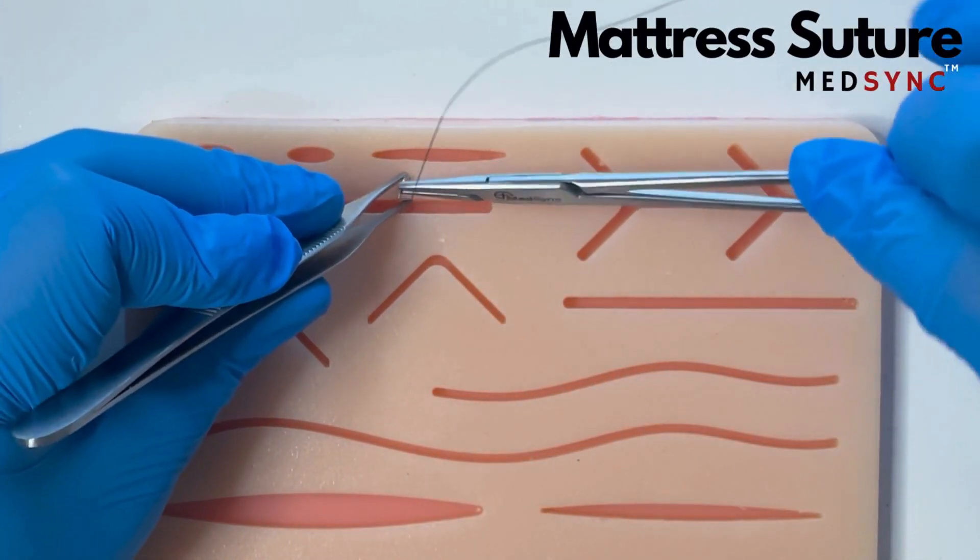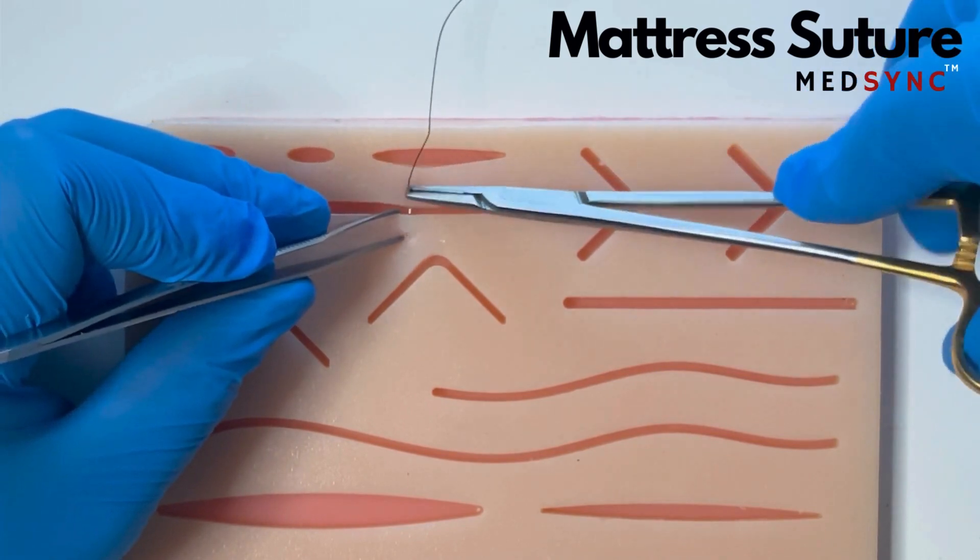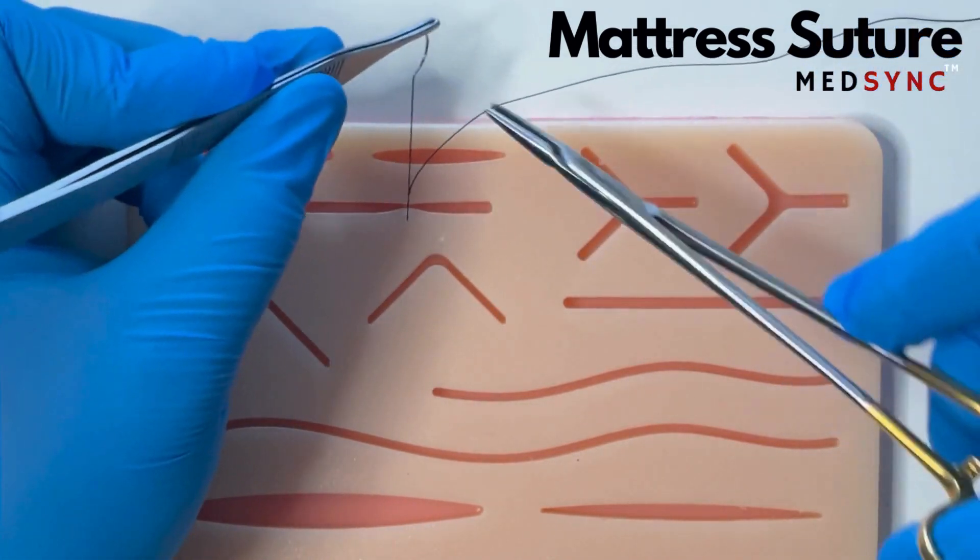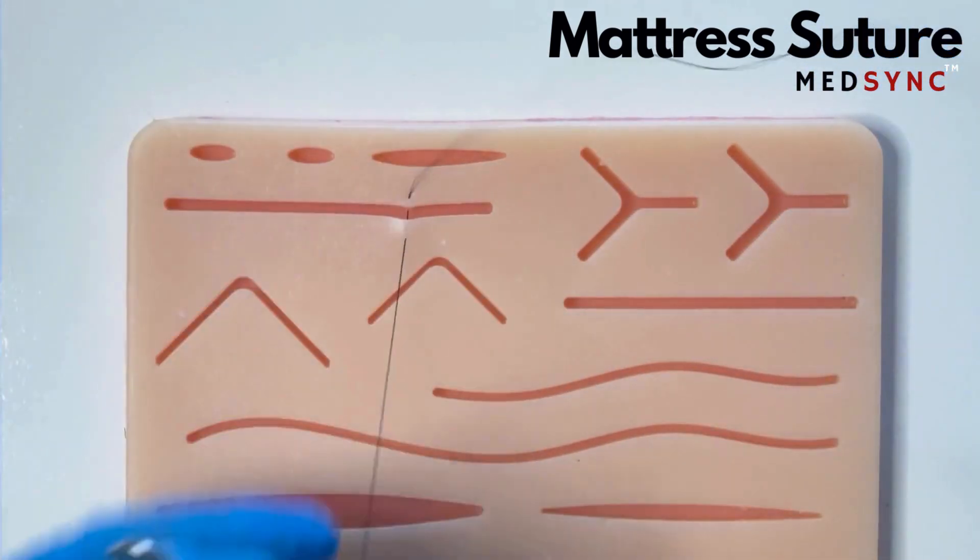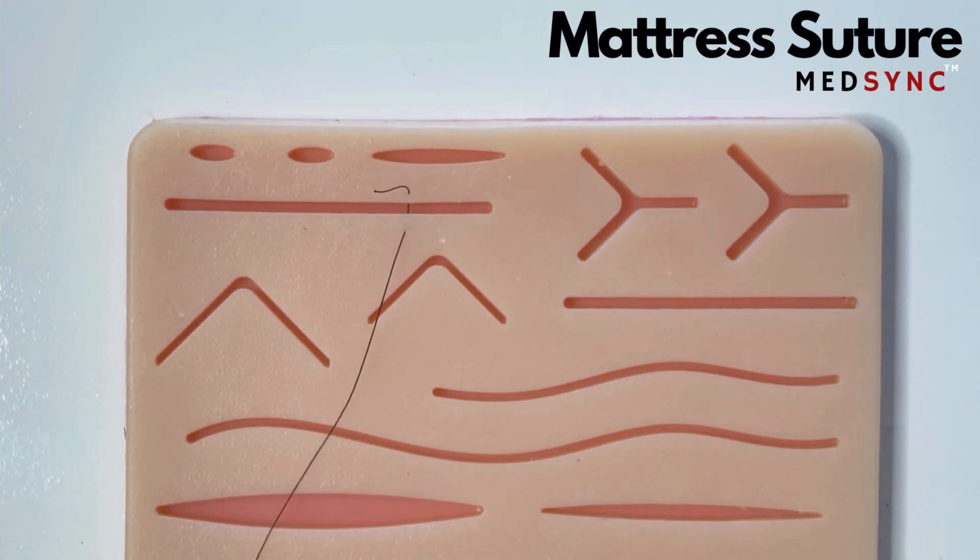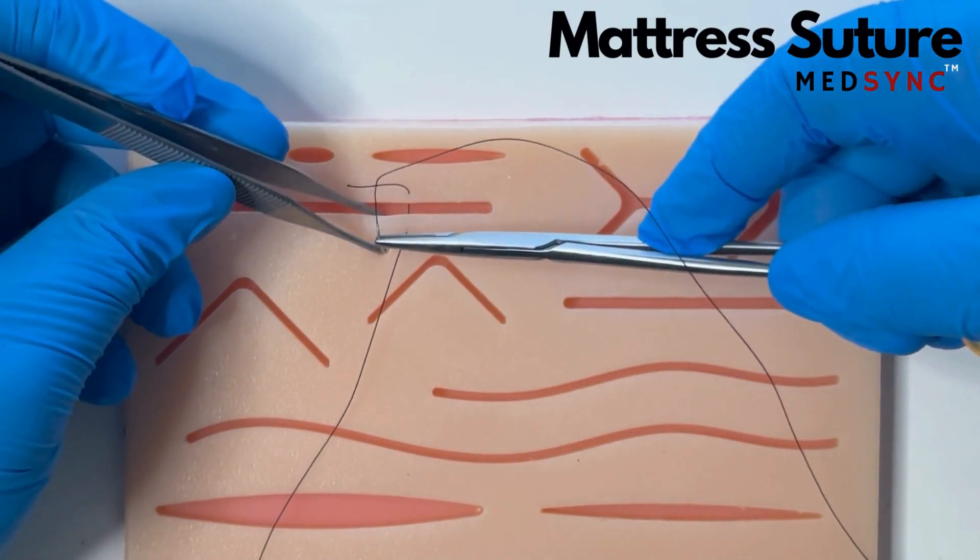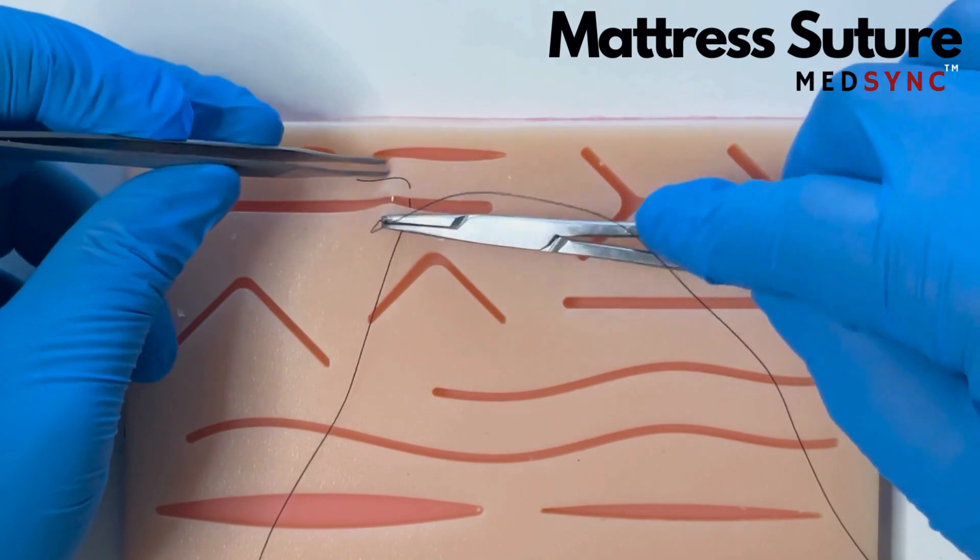The Horizontal Mattress Suture. You take a bite across the wound, you turn the needle around and take a bite back across the wound. You start next to your exit point and you finish next to your starting point.